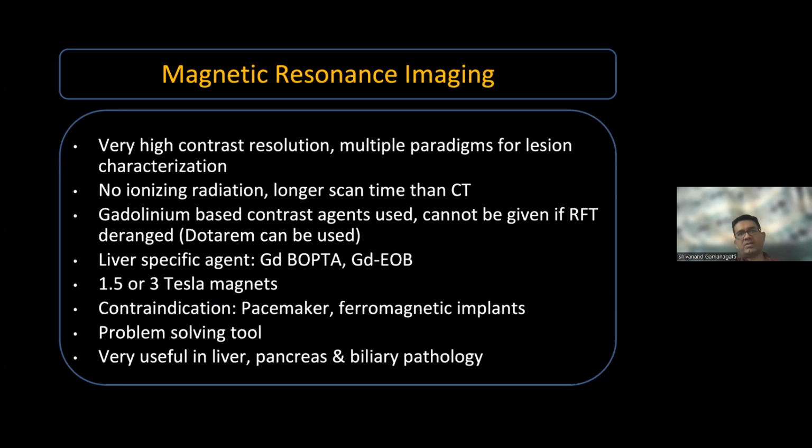So if you ask me which is the better modality for evaluating a liver focal lesion, multi-phase CT or MR, it is MR. But the problem with MRI is availability, the long acquisition time and the breath hold. If the patients have ascites, breath hold will be problematic. If none of these problems are there, the MRI outweighs the CT. Considering the cost, that is a different issue. But in terms of advantage, obviously MRI plays a better role.